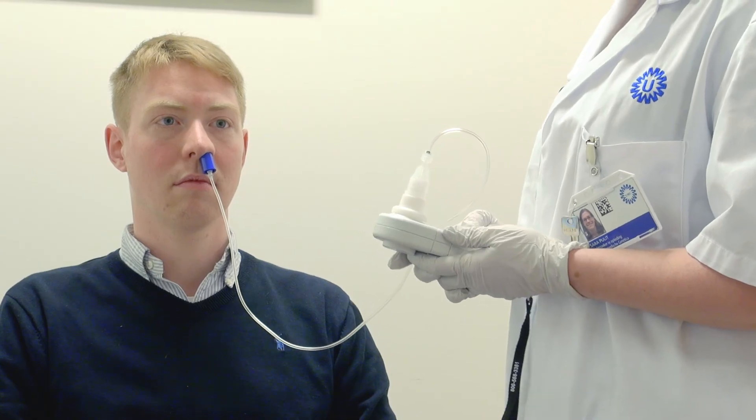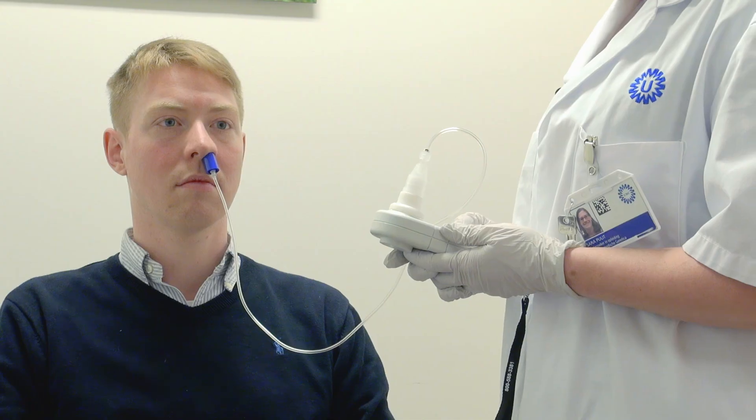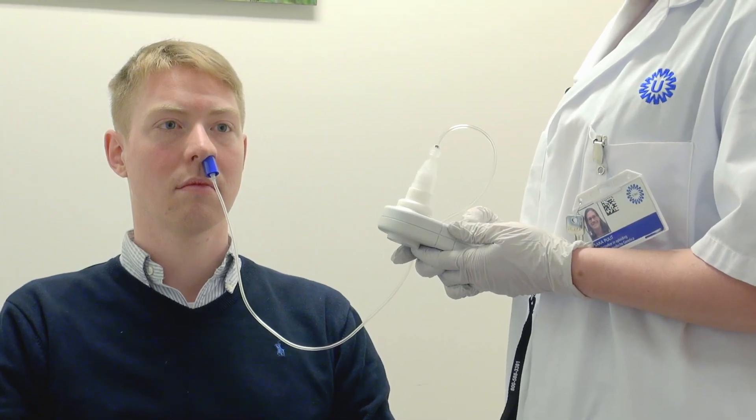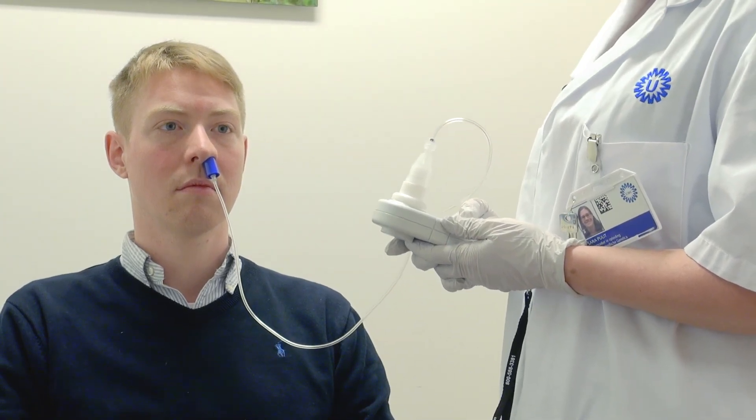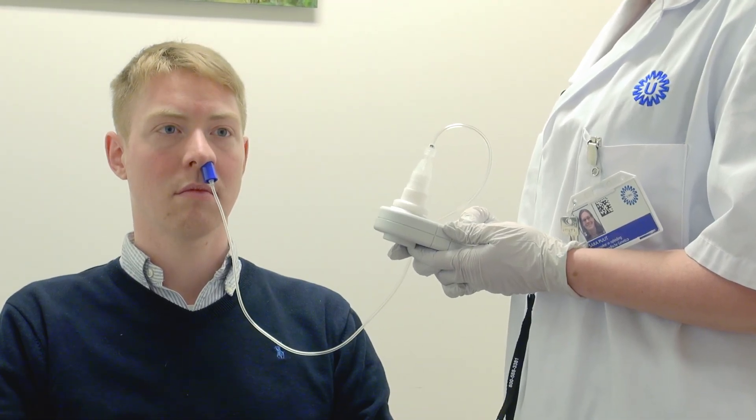The device is ready. The test is exactly the same. On the count of three, keep your mouth closed and take a short, sharp sniff inhale. Ready? One, two, three.